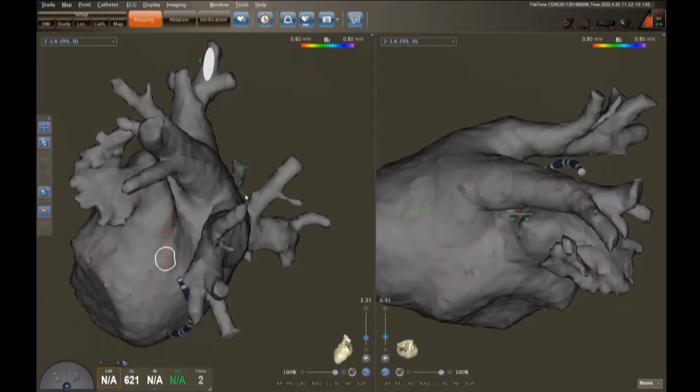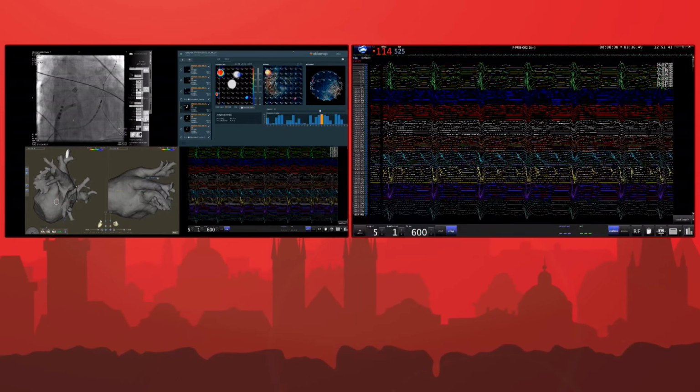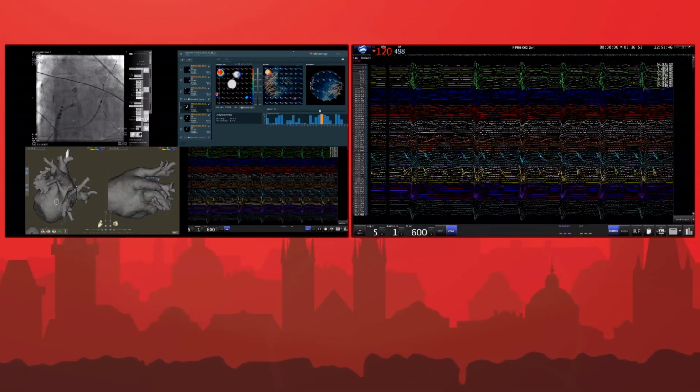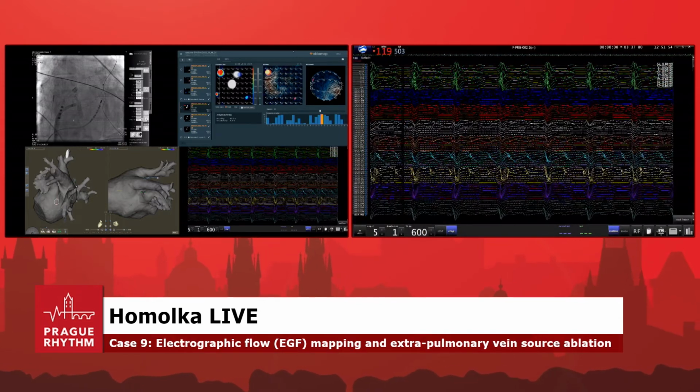So we just did the PVI, okay? And Toshi's done, as you saw him rotating and everything. Now what we're going to do is put the basket catheter back in. You can show him fluoro too, please. We're going to put the basket catheter back in, and we're going to do another acquisition. Hopefully this is somewhat clear what we're doing. You can see the patient still in AFib. Can they see the map up there? Okay, good. Let's see what we see here. This is going to be interesting.